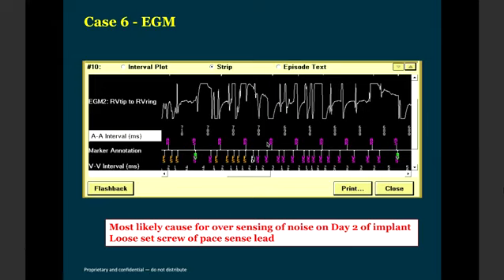In a particular case, you have the luxury of reprogramming from one to the other if one doesn't have a good sensing amplitude. But having a coil as a vector also has a disadvantage. If the coil is close to the tricuspid valve, it can pick up atrial signals. If it is deep in a large dilated right ventricle, this concern is not there, and if the distal tip to ring sensing amplitude is not up to the mark, I will definitely use the tip to the coil.